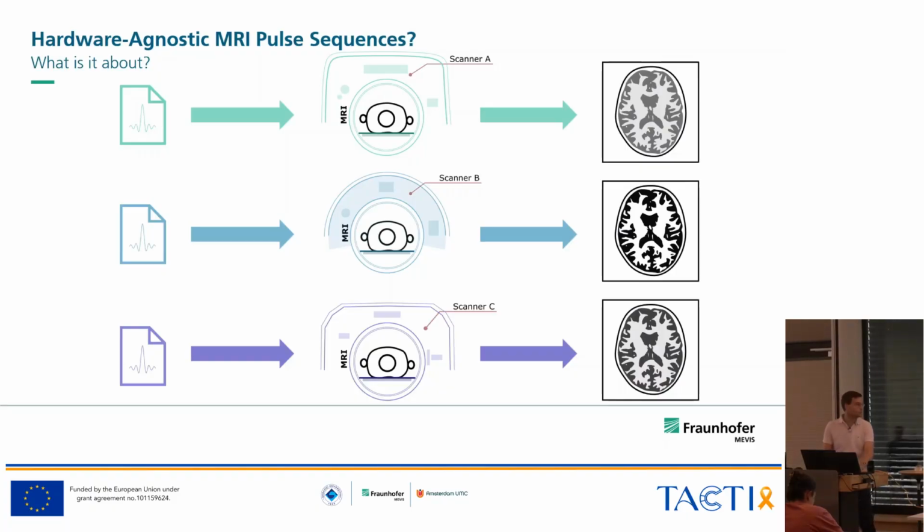What that also means is that there are redundant copies of exactly the same MR sequences with little differences in details, so that if you think about going to a clinic that has different MR systems, for example, of different vendors, you cannot be sure that you really get the same comparable image results because of slight differences in the sequence implementation.